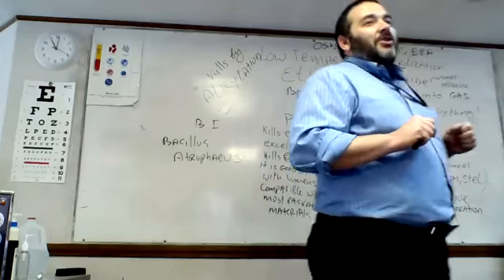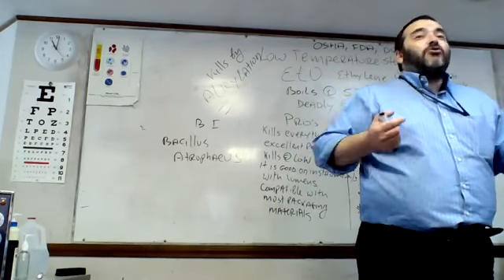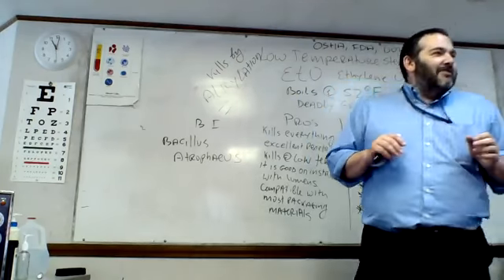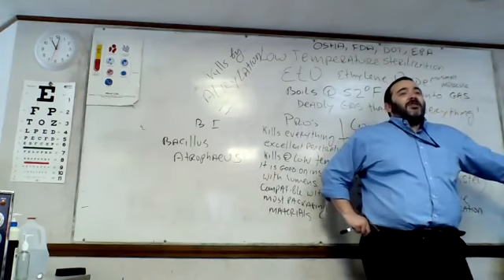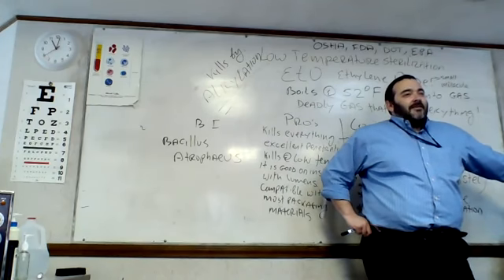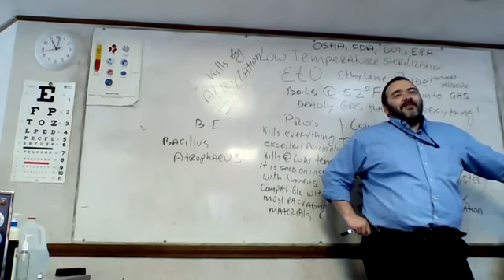Got it. Geobacillus stearothermophilus for everything else, and Bacillus atrophaeus, God, I hope I spelled it correctly. We'll check with the book a little bit later. Close enough. So, Bacillus atrophaeus is the biological indicator for ethylene oxide. Comprenez? Oui. Oh, very nice.